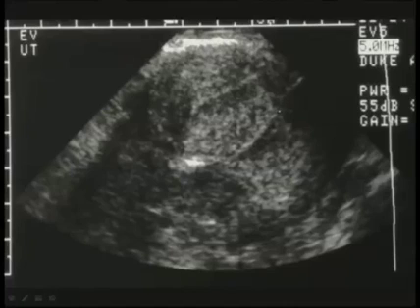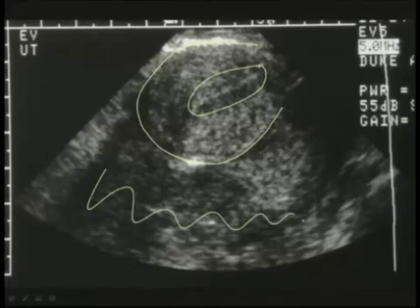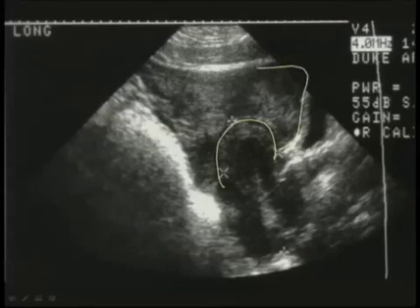This is an endovaginal view, of course. And this is the outline of the uterus. Inside the uterus, you'll see that there's no intrauterine pregnancy within the endometrial stripe. And there is, posterior to the uterus, all this echogenic material, which is somewhat amorphous. From the transabdominal view, it becomes quite obvious that here is the uterus and that there is a large amount of blood that is sitting right on top of the uterus and creating that low-level and medium-level echo pattern that we saw on the earlier image. This, which was difficult to perceive from the endovaginal view, is quite obvious on the transabdominal.